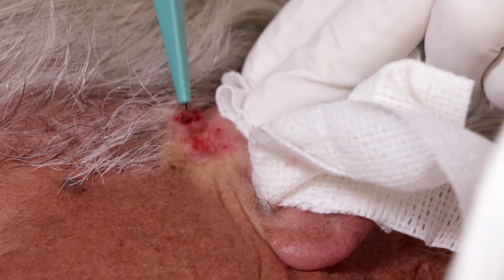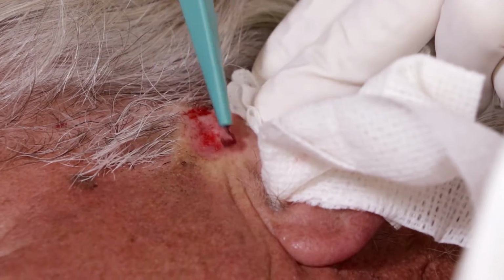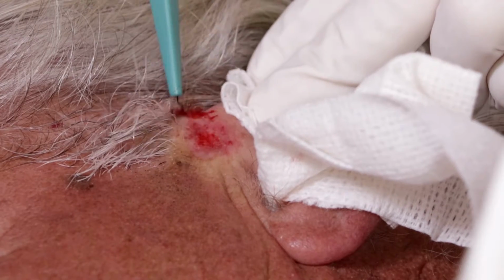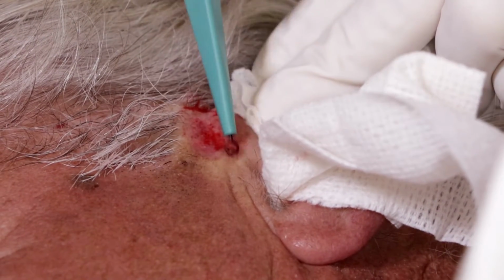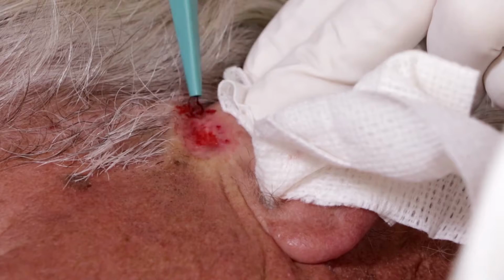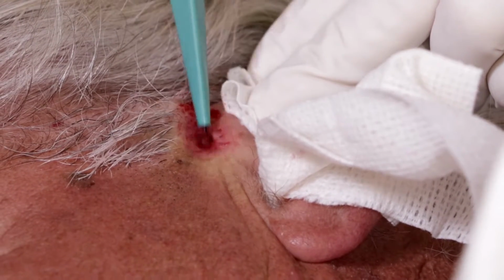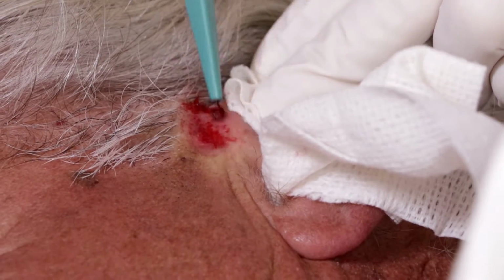Can you feel it? I can. Yeah, you can feel that roughness, the scratchiness. And then it goes away as you get it off. So that tells you where the cancer is and where it isn't. Amazing. Pretty cool. Still scratching. But you can tell it goes smooth when you do get it.